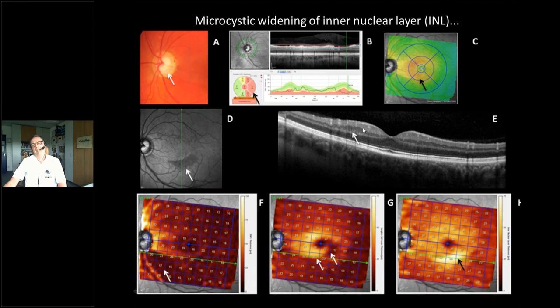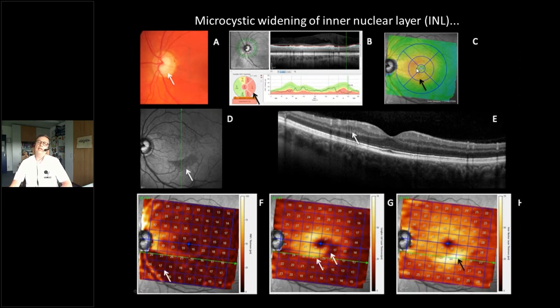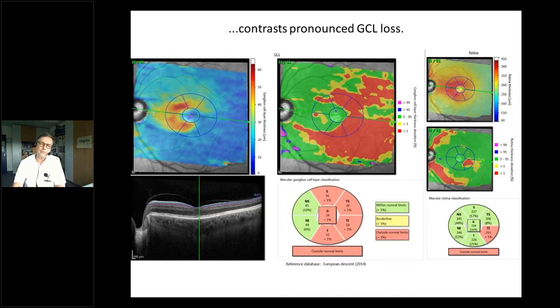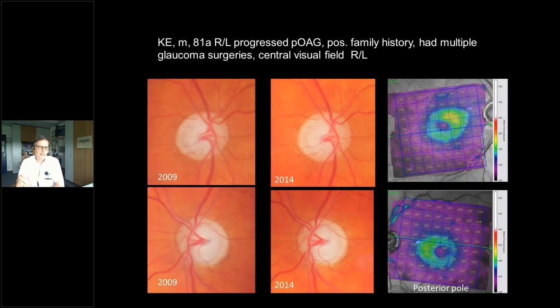Microcystic widening of the inner nuclear layer combined with thinning of the ganglion cell layer means total retinal thickness has not changed, so it's not flagged. Therefore, look at the ganglion cell layer directly in good segmentation. If you suspect cystic spaces, look at the vertical scans of your macula to detect them. The loss of ganglion cells is nicely flagged in the deviation map, where we see pronounced loss in upper and lower halves — this is a very much progressed patient from 2009 to 2014.